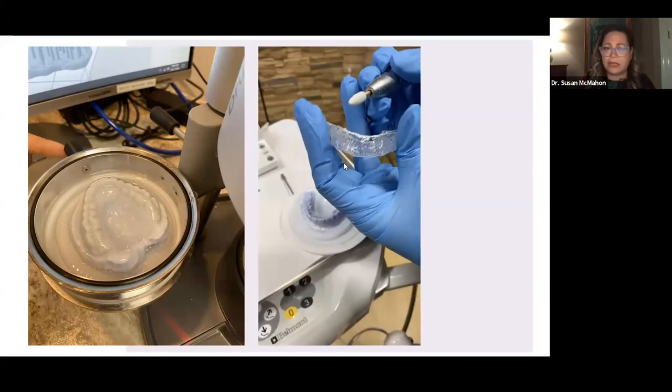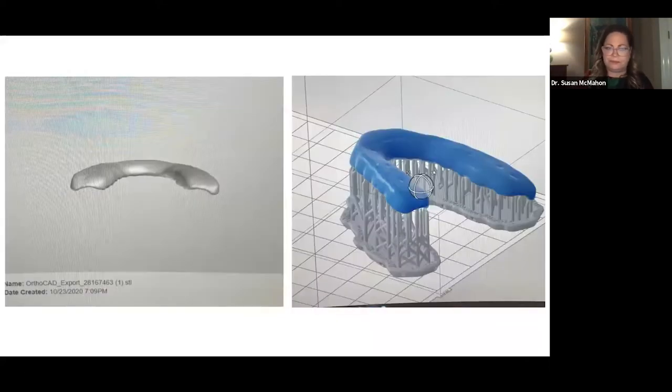So we were delivering occlusal guards in about a week to people. If you needed one, we would diagnose it. Sometimes they would say, yep, you can take an impression today. Other times they were scheduling to come back. So that's another chair time, another whole infectious disease control situation. And then a week after that, we were delivering their guard.